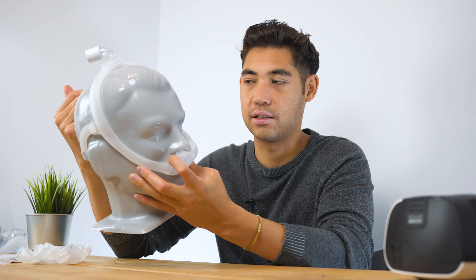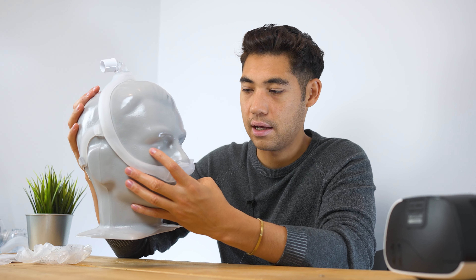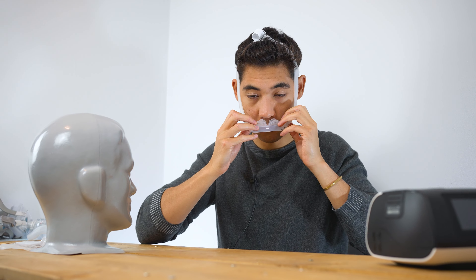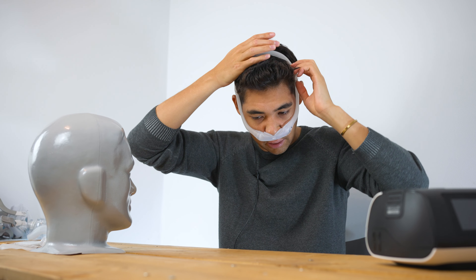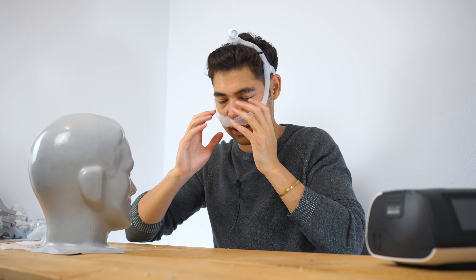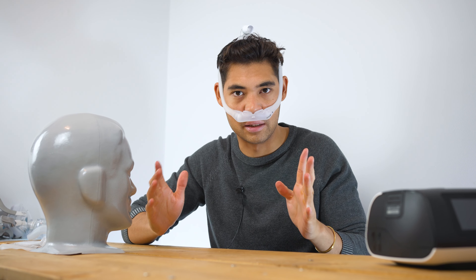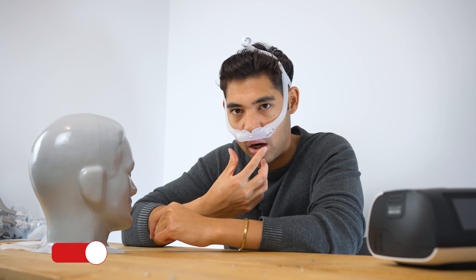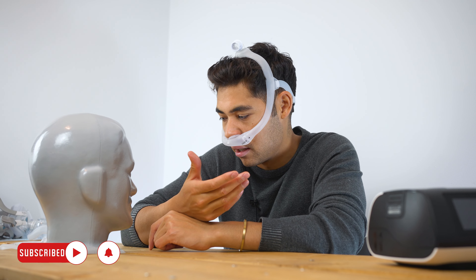The exhalation port at the front is just a dot — there's no diffuser. A lot of pillow masks, for example the Fisher & Paykel Bravada, have a synthetic wool diffuser that keeps things quieter. More importantly, it doesn't blow the air you expire in a straight line. With this little dot, if you breathe out really hard, it's a little jet stream of air that could get annoying depending on how sensitive your partner is to that. So that's con number one.